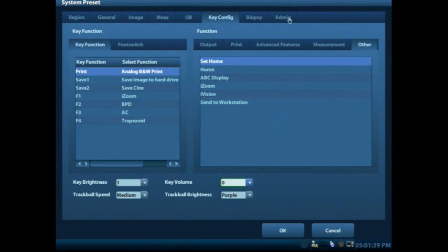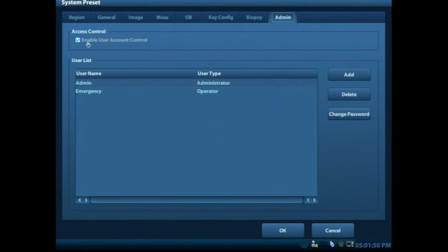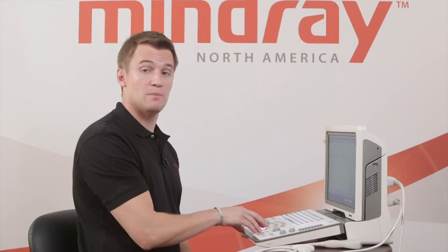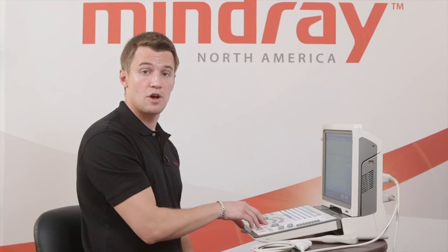One thing I recommend doing when you go into the setup menu on the system preset is going to your admin selection. This is where you see that enable user account control. And if you deselect that box, what you'll find is that when you boot up and boot down the machine, you won't have that login screen that comes up.